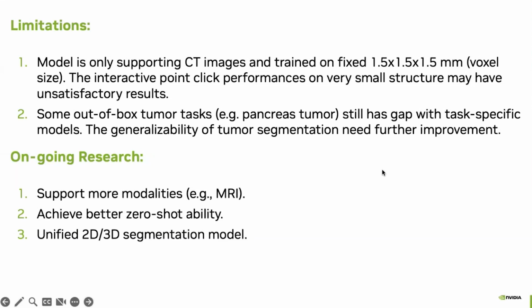So the performance on very small structures may have some unsatisfactory results because we limit the resolution. The second is that some out-of-the-box tumor tasks, like the pancreas tumor, still have a gap with the task-specific models. The generalizability of tumor segmentation needs further improvement.